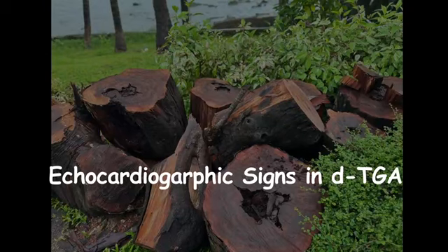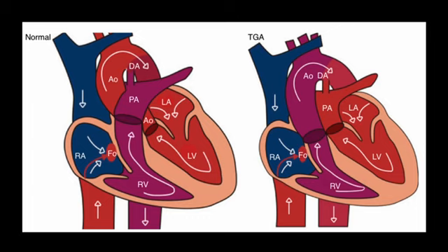Today we are going to see some of the important signs that we see in fetal echocardiography in the case of transposition of great arteries. We all know about the fetal circulation and the preferential diversion of the oxygenated blood from the umbilical vein into the ductus venosus and to the foramen ovale to the left atrium. And the two shunts which are in the fetal heart are foramen ovale and ductus arteriosus.